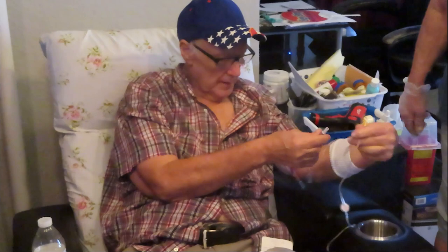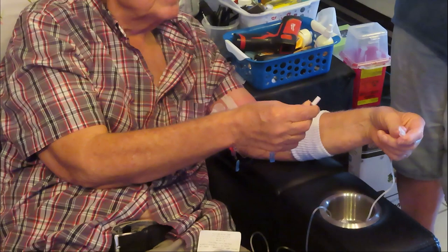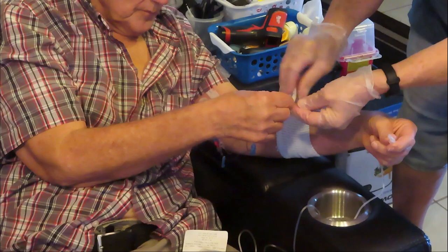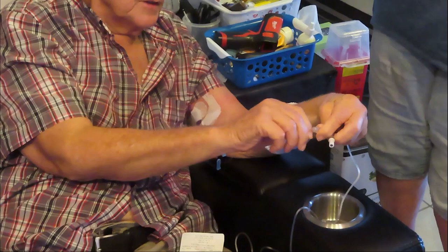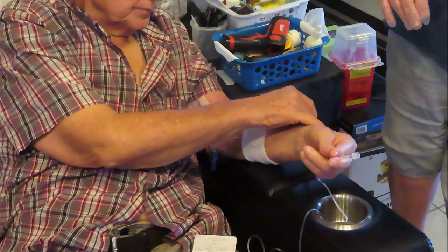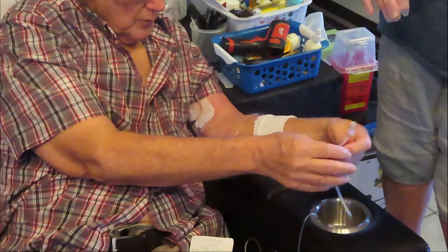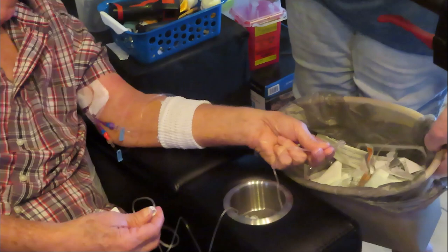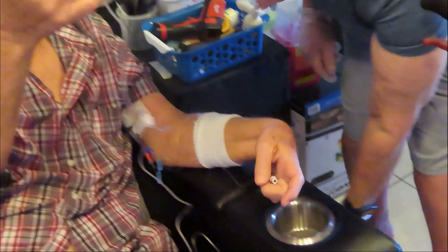Now the procedure is going to get an alcohol wipe, clean the end off. Okay, next thing I like to do is to unscrew this end here. Let's do this one first, or should we flush that? Yeah, well, we're going to do this. And we're going to unscrew this end here, and I like to prime this. So usually get the garbage can handy, and you just open up the valve here. Just let it drip out. Okay, so the hose is primed, so now there's no air in there.